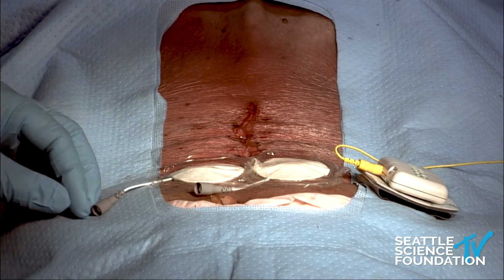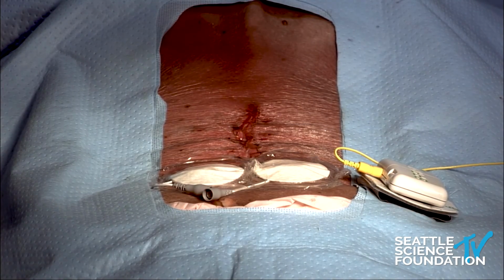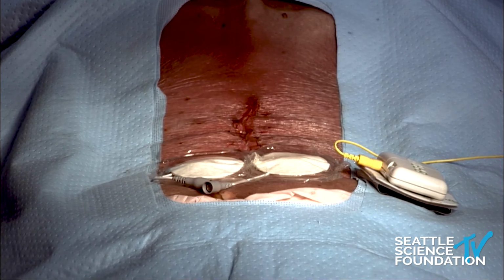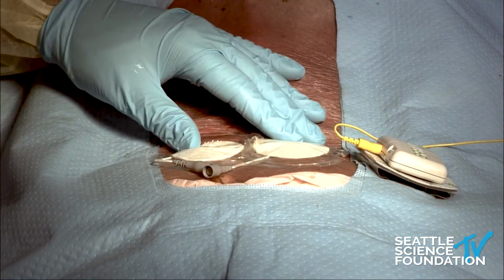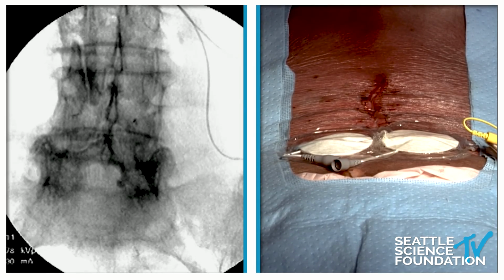And that's what it looks like afterwards. So again, the patient can then have the connector box or EPG wherever they want, on their flank, their abdomen, as long as we can get the cables to run over. So that's what it looks like procedurally. If you want to take a fluoro shot, go ahead, Victor, there. You can see the leads, guys, right there, right on the lamina. So this is our medial branch peripheral nerve stimulation using the SPR Therapeutics device.